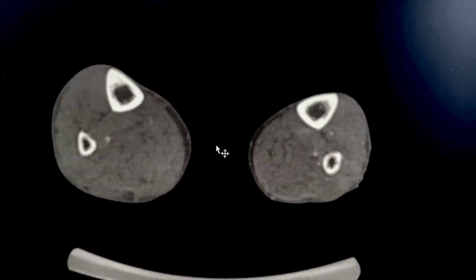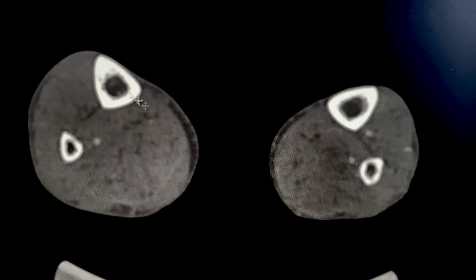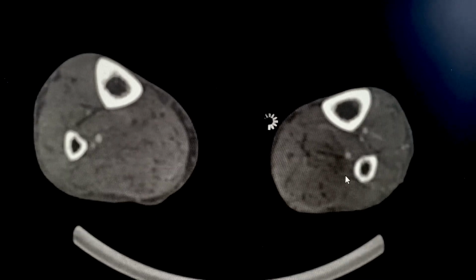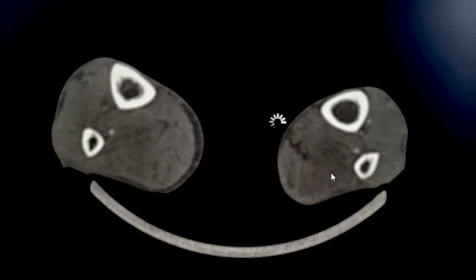And as we continue down, so now you can see that only the peroneal artery continues feeding this limb, whereas on the left, the posterior also is finally occluded, leaving us with the anterior and the peroneal artery, and then we continue all the way down the lower limbs.